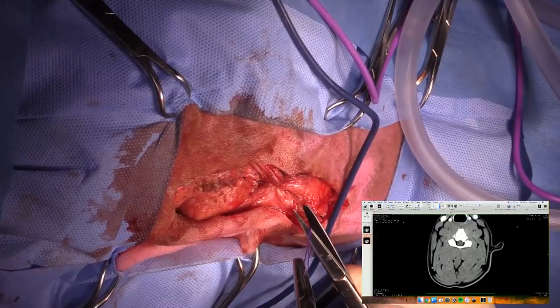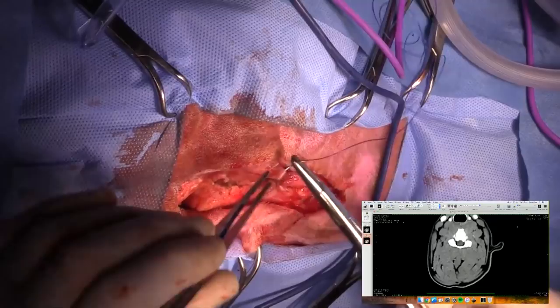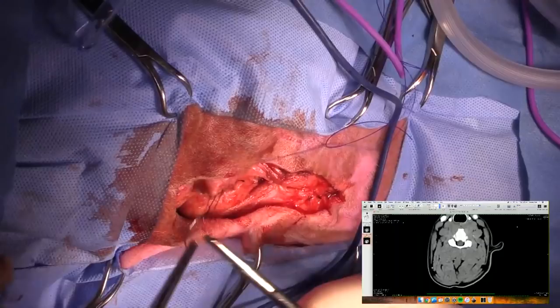And we don't need to submit that for histopathology, although we have already submitted a culture. Be careful not to pick off my maxillary vein. After taking all this time and effort to make sure that I'm not losing a lot of blood, so you guys won't judge me. It'd be embarrassing to damage the veins on the closure.